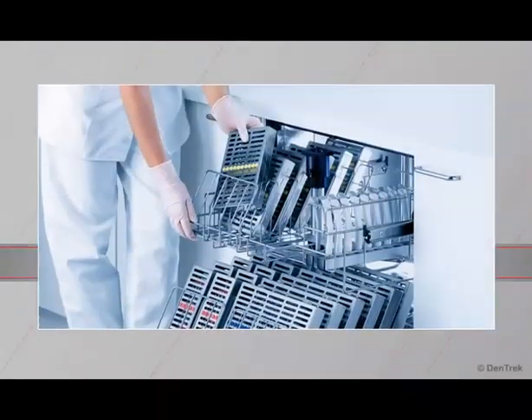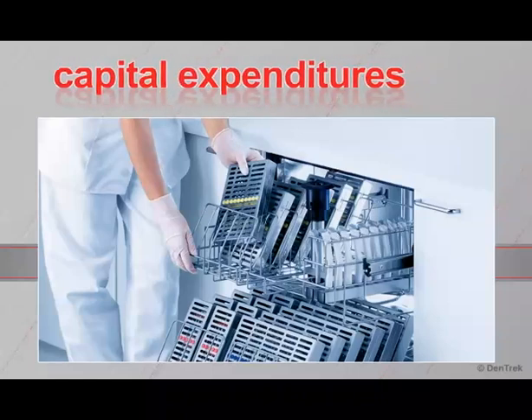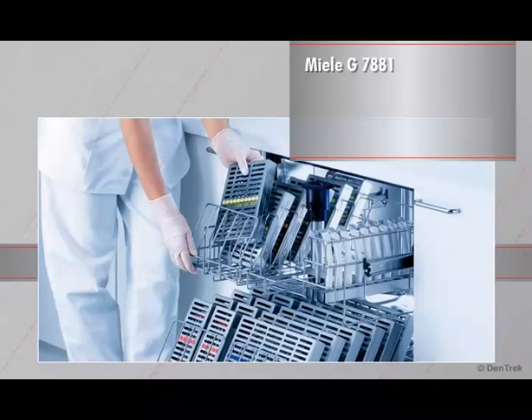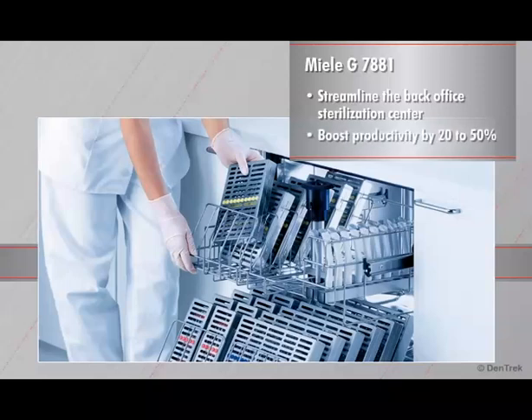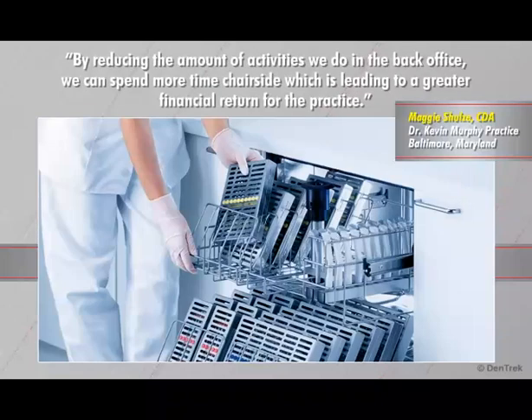Today, more than ever, dentists are challenged to justify capital expenditures in their practices. With the Miele G7881, you not only streamline the back-office sterilization center, you boost productivity by 20% to 50%. With the Miele G7881, we achieved an immediate 20% increase in doctor productivity. By reducing the amount of activities we do in the back office, we can spend more time chairside, which is leading to a greater financial return for the practice.